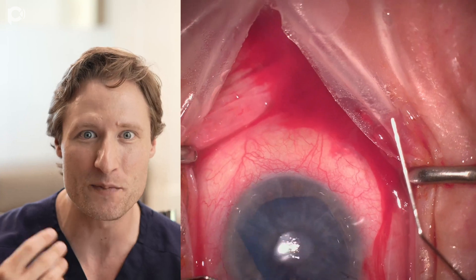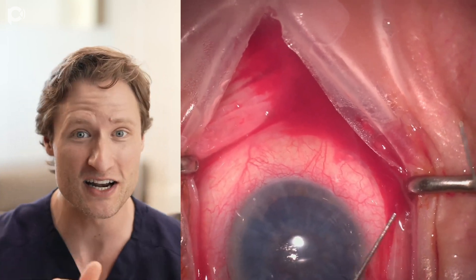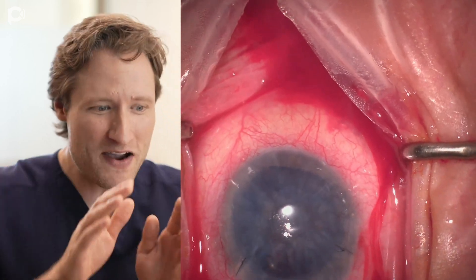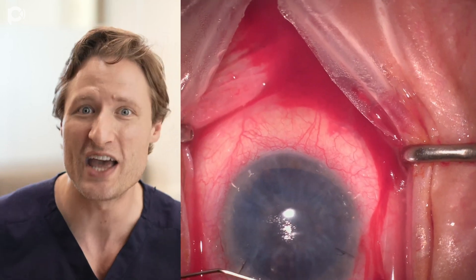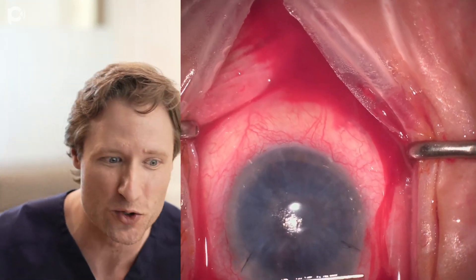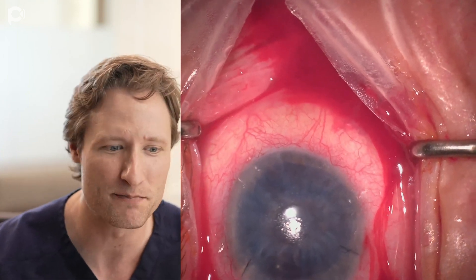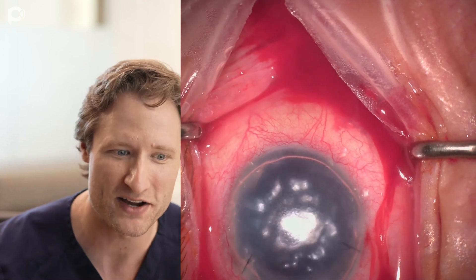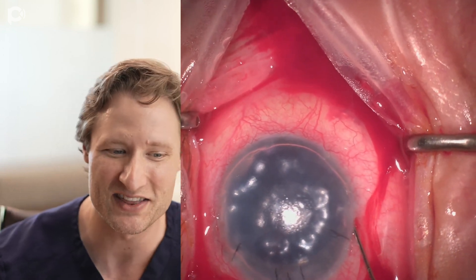The help-yourself technique is not quite as useful in this case as it normally is, because the chamber is so shallow. When you have a really shallow chamber, you push the graft over, but rather than separating the two edges, the whole graft tends to slide over together as one unit. These are Descemet's membrane taps I'm applying to open up this last little lingering edge. The key to getting this graft to unfold was making sure it was well centered in the eye — if the graft is shoved to one side, it's much harder to unfold the edges.